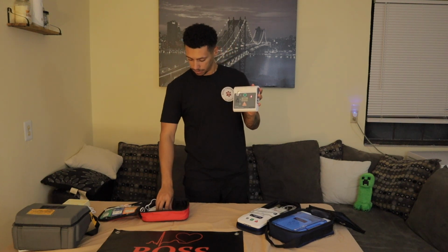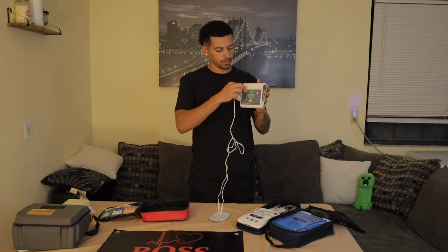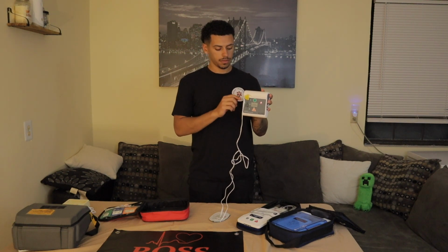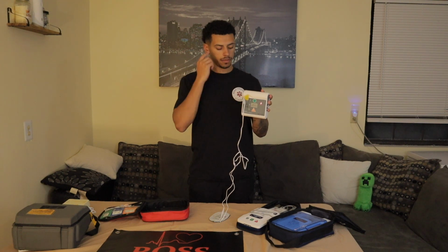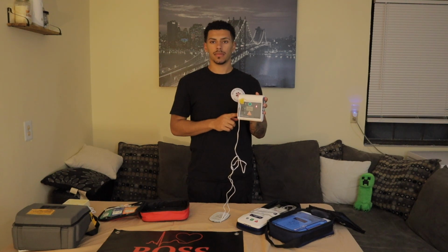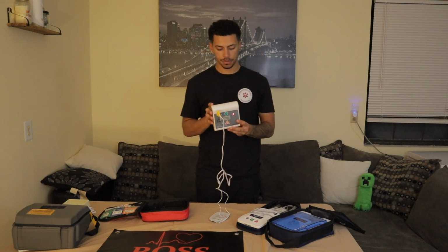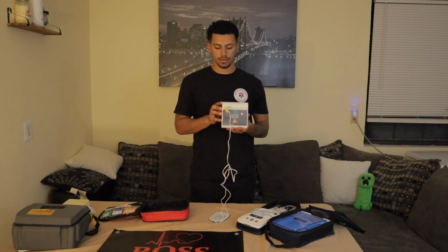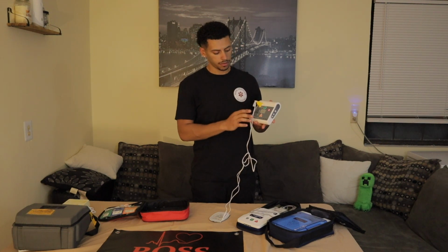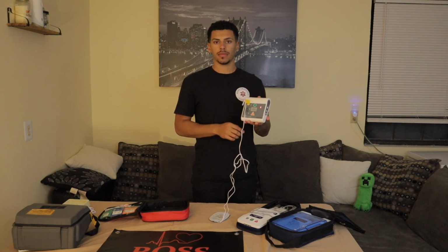Apply pads to patient's bare chest. Plug in pads connector next to flashing light. Analyzing heart rhythm. Do not touch the patient. Shock advised. Charging. Stay clear of patient. Deliver shock now. Press the orange button now. Shock delivered. Begin CPR.